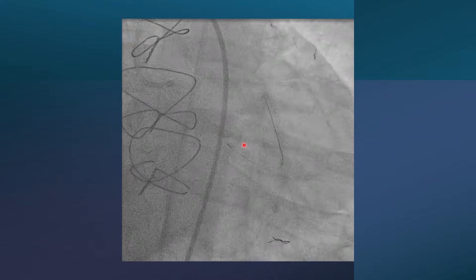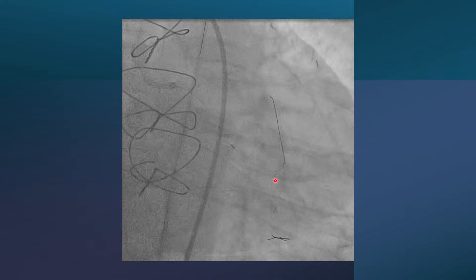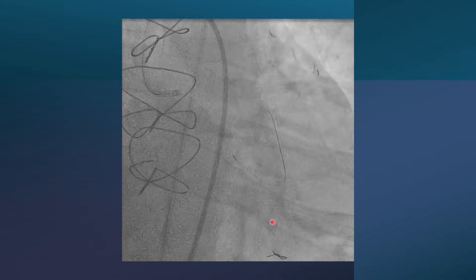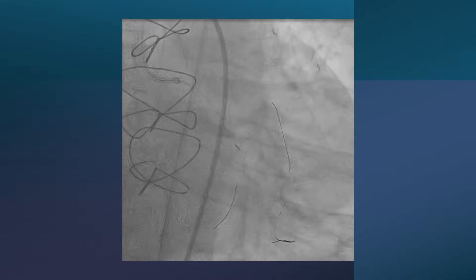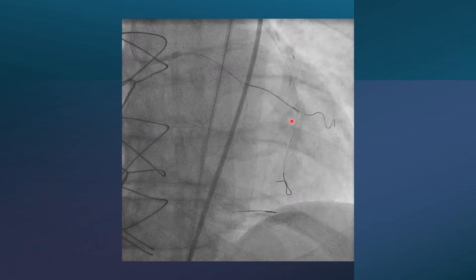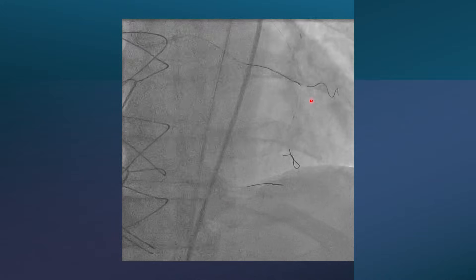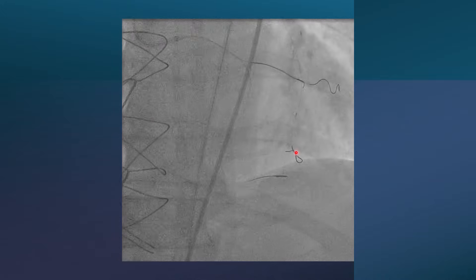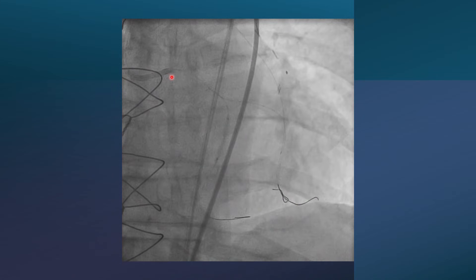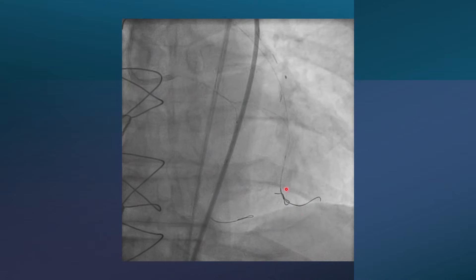The further challenge was navigating from the OM through the trifurcation into the main circumflex branch, since the retrograde wire was coming from the SVG and the antegrade wire was also directed toward the SVG. Again, this was only possible using the dual-lumen Sasuke microcatheter, through which we advanced a wire into the main branch of the OM. We now had two wires: one in the body of the circumflex and one through the OM to the distal branch.